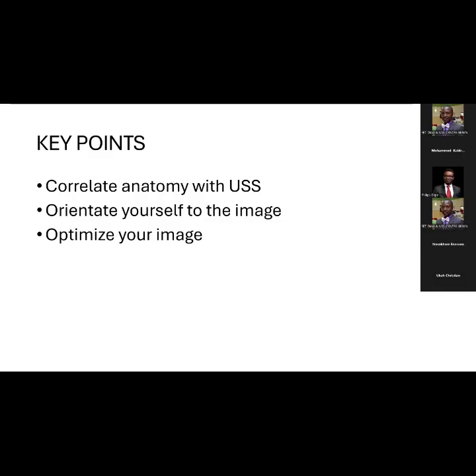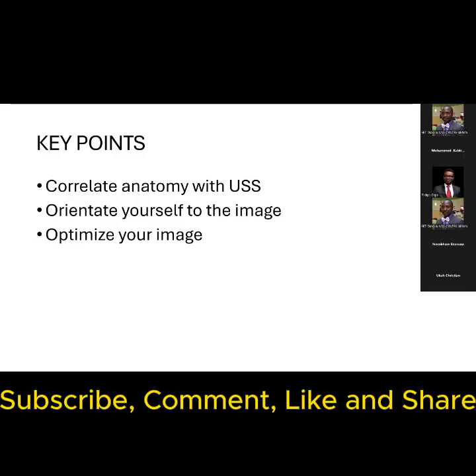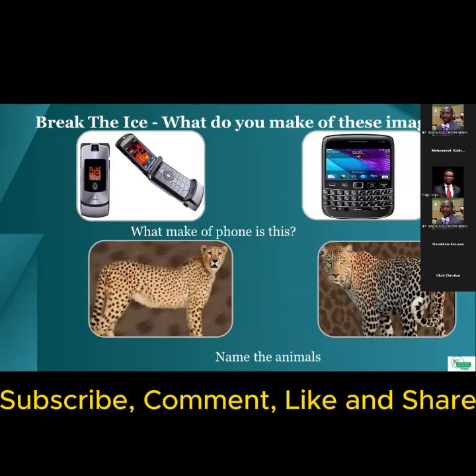Prof. Okay, that looks like a very vague question. Gynae scan for what indication will be the first thing. Are you looking for follicles? You will do it multiple times. Are you monitoring the endometrial changes across the menstrual cycle? You probably also do it multiple times. Or are you looking for evidence that the woman has ovulated? You will do it later on in the mid-luteal period. So it totally depends on what you're asking for.